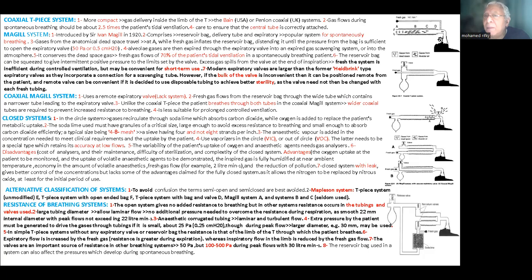So sometimes whenever we need extra flow and there is not enough minute volume, the patient may withdraw this peak flow from outside the breathing system, causing rebreathing.